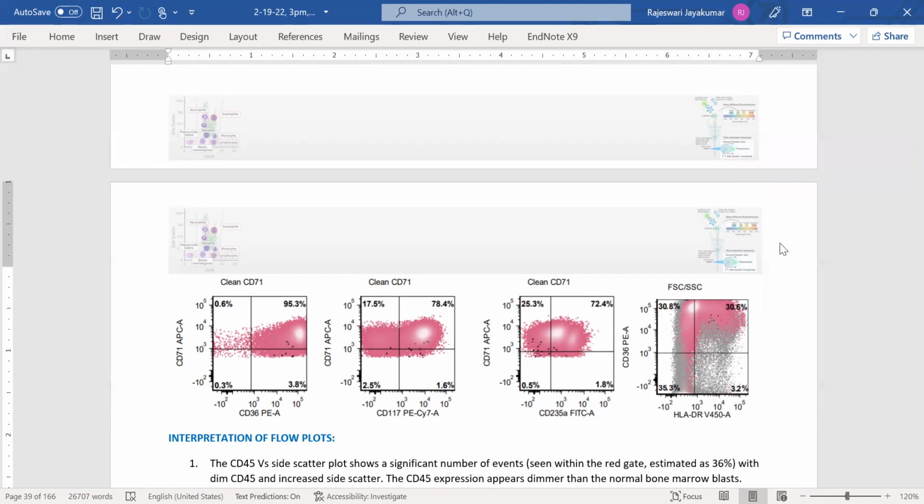If you're using a tissue specimen, E-cadherin and spectrin can help. Those are specific markers for erythroid lineage. So here we see that 235 is partially positive. So 235 is, like I said, a specific marker, but it is acquired by the erythroids a little later in their maturation phase.